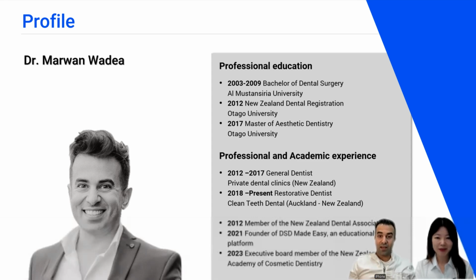In the end, the exposure to Medit was an eye-opener. It was the gate towards all the applications Medit has to offer. So I had to apply exactly the same principles that I used to work with Mesh Mixer, but it's in a much better and refined software.